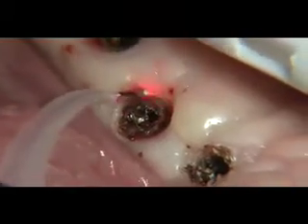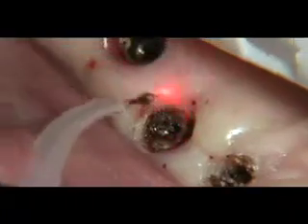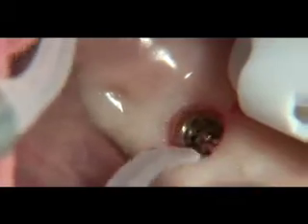A quick, safe and dependable technique for exposing implants employs the use of diode lasers. After unscrewing the healing abutment, overgrowing tissue within the recess can be melted away quickly with the side of the laser fiber using slight amounts of infiltrated local anesthetic.